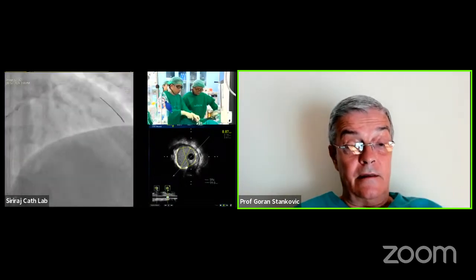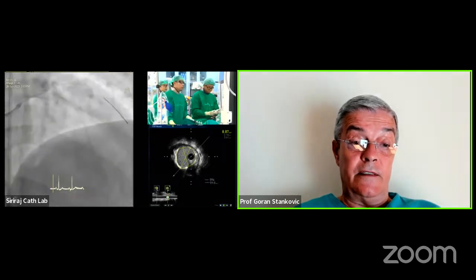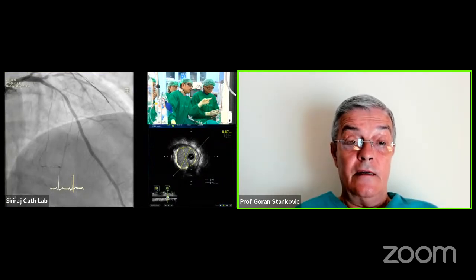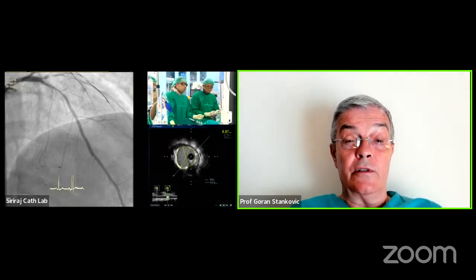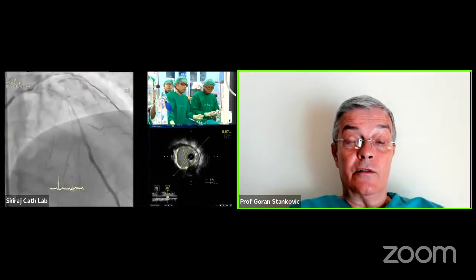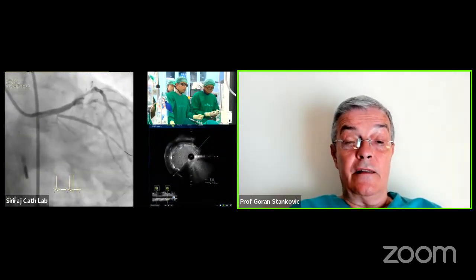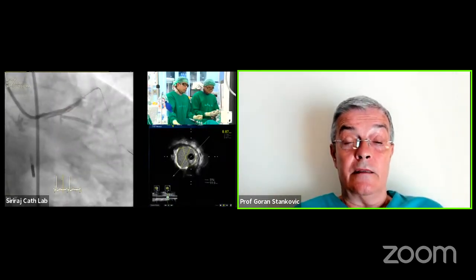And COBIS 3 at 5 years did not show any difference in systematically opening the ostium of the circ following crossover stenting. The same for the Milan-Tokyo registry, again at 5 years, no difference in outcome. So if we are where we are now with the stent close to the ostium and a good result after POT, knowing that with elliptical expansion, if you use 4.5, you actually elliptically deform the ostium of the circ, which may create an angiographic impression of a significant lesion, but usually the area is preserved. So I don't know if I'm right, but I guess I will stop at this point.